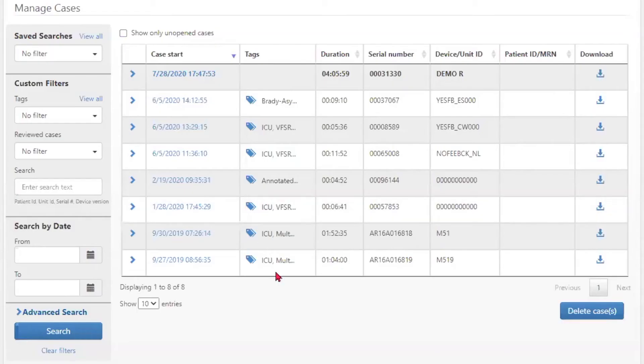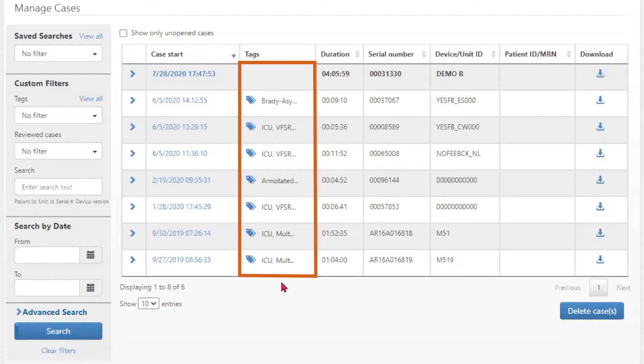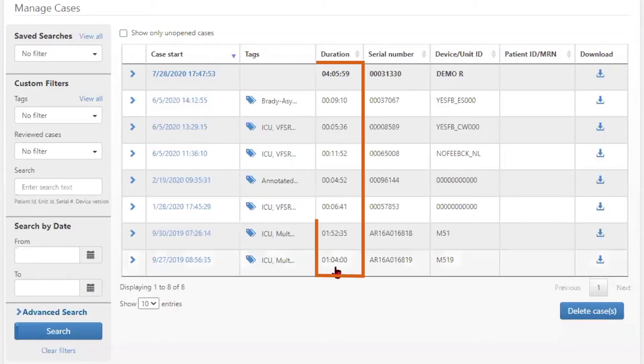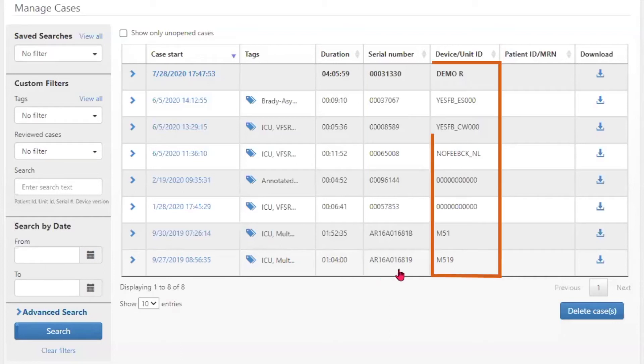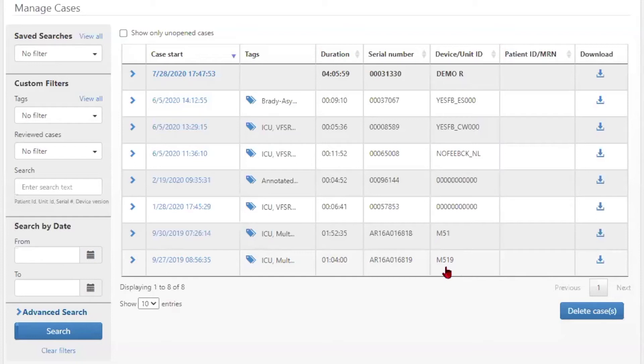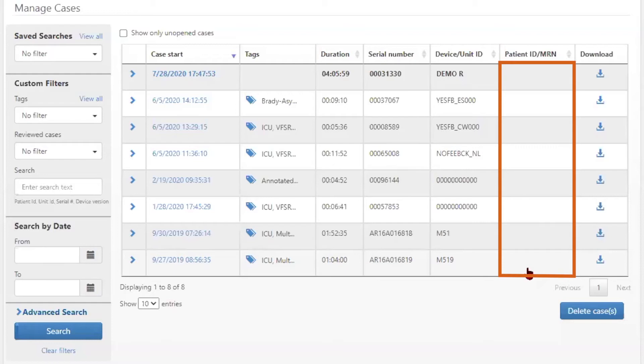Cases are further identified by any tags that have been added to the case, the duration of the case, the serial number of the device that generated the file, any device or unit ID if available, and the patient ID or medical record number if available.